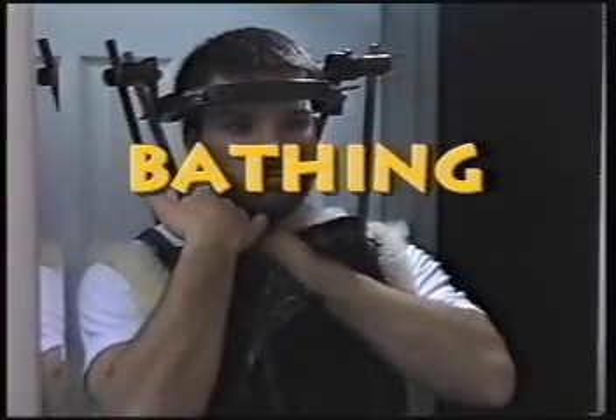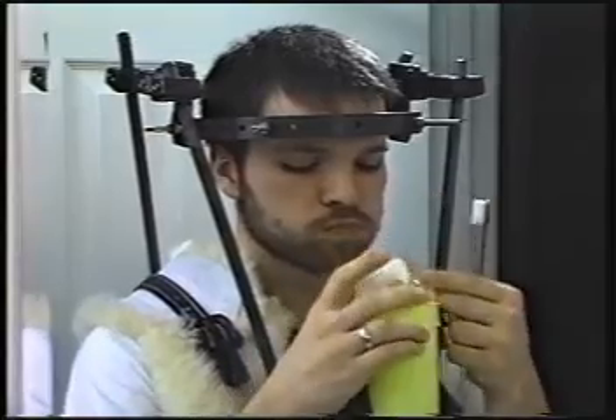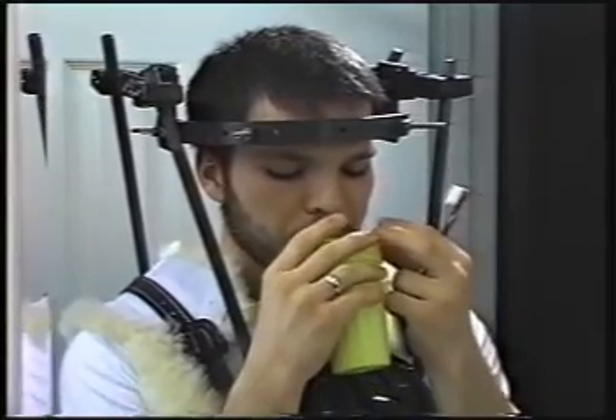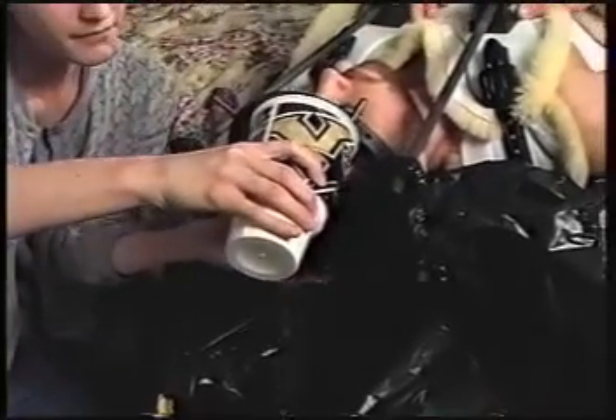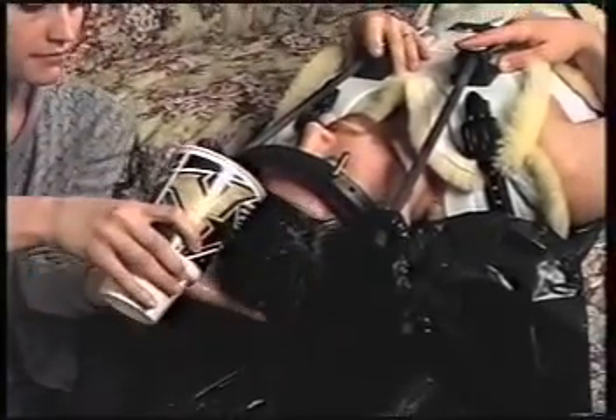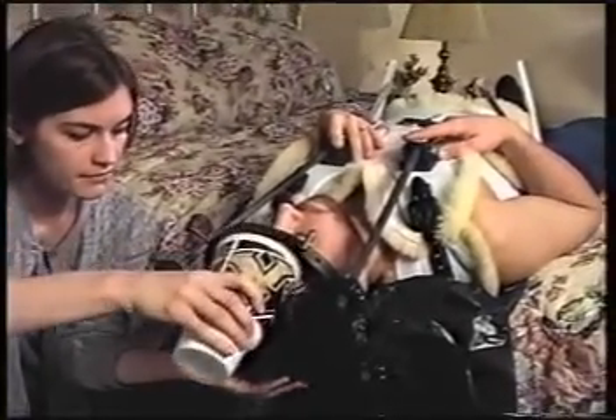Since you cannot remove your vest to bathe, you will need to protect it with plastic or towels to keep it dry and then take sponge baths or tub baths using just two or three inches of water. You should not take showers. You will quickly learn how to brush your teeth without bending over, using a cup of water with a straw to rinse. Washing your hair is a two-person job. Make sure your vest is protected with towels or plastic and then have your helper lather and rinse while you lay on the bed. The water will run down the plastic into the bucket.